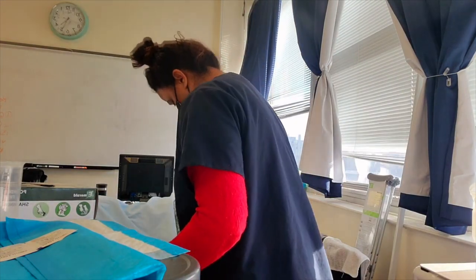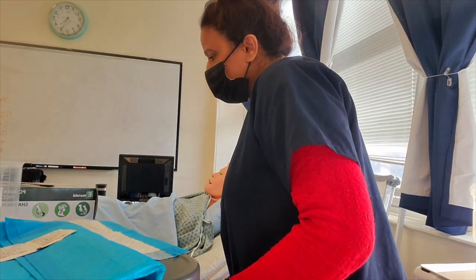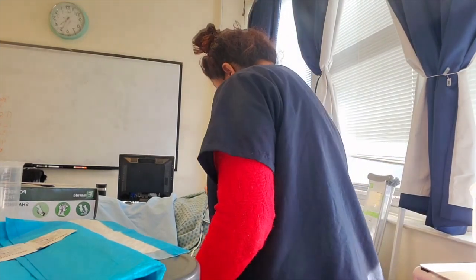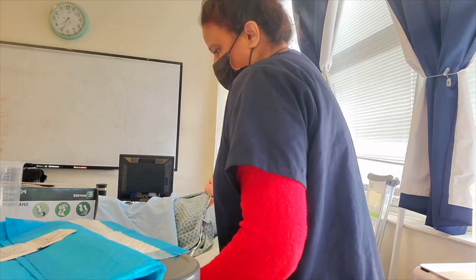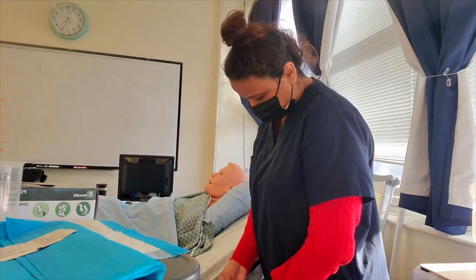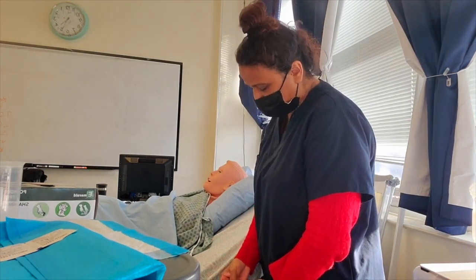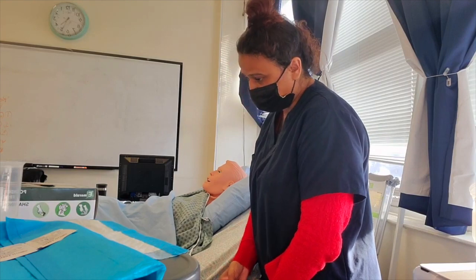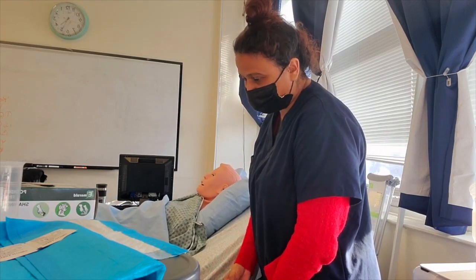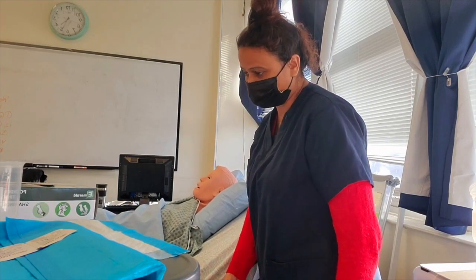After maintaining privacy, make sure the bed is at the right level. We're measuring output, so the Foley bag is at a certain angle — we may have to lower the bed, because when you drain it, it has to be at a certain level.